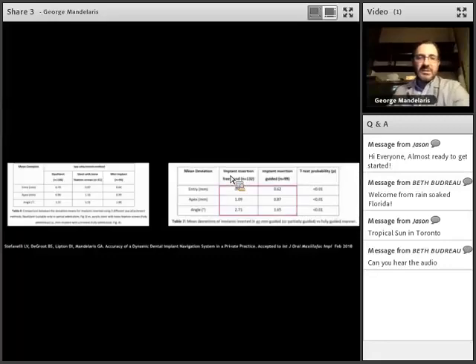I wanted to share this with you because this is one of the most interesting aspects. The question is, once you've done the osteotomy site preparation, do you then need to use the implant as a drill, register the tip, and place it using the technology? And the answer is probably yes, you'd be better, but not necessarily. Because when you look at Luigi's numbers, when he placed the implant freehand, but had created the osteotomy site using dynamic navigation, his numbers were a little worse, but not too bad.